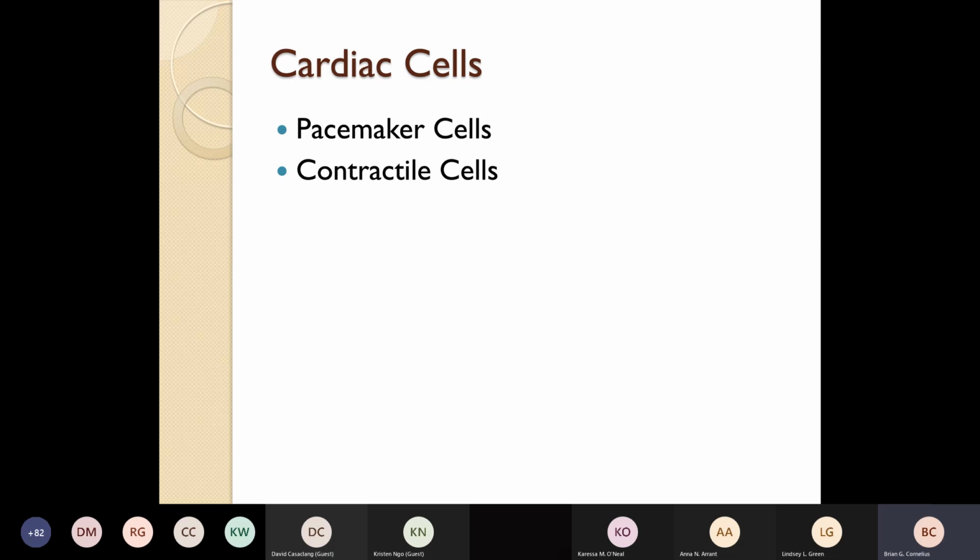And then finally, the last thing I'm going to say as we move through that: you have got to know the rules for EKG interpretation. If you've always gotten by just looking at things and guessing what the rhythm is, you're going to be in a rough situation here, because EKG rhythms can change very quickly, but they can also change very subtly. So you need to make sure you're aware of the subtle differences between ST elevation as you would see with an MI, or T-wave elevation like you would see with hyperkalemia.